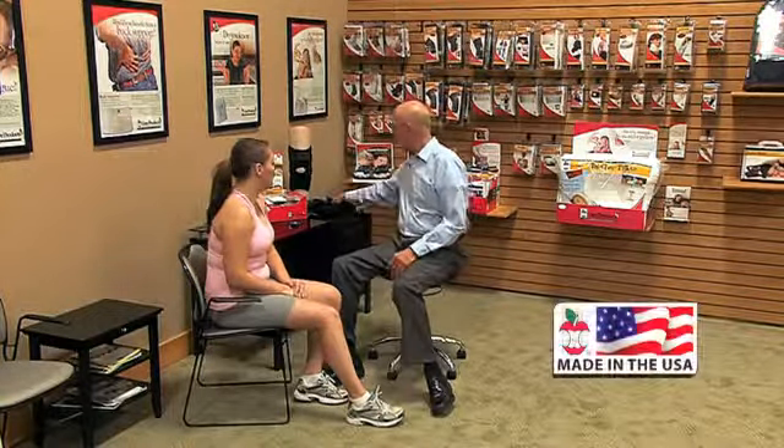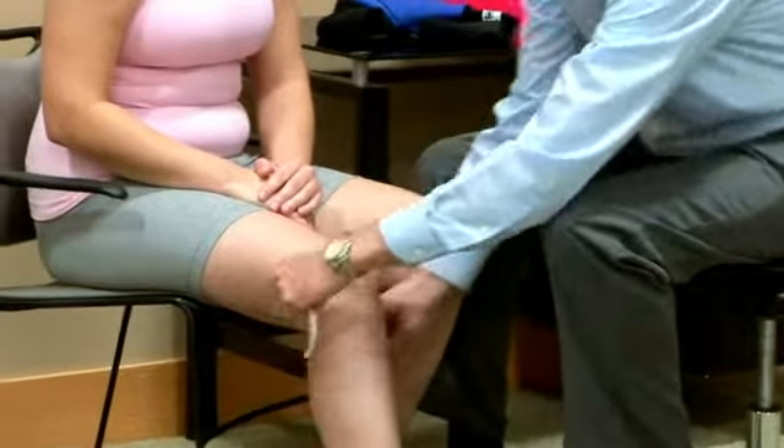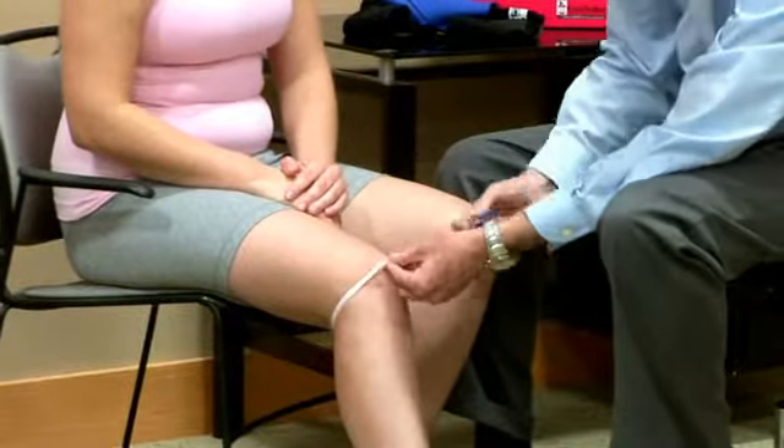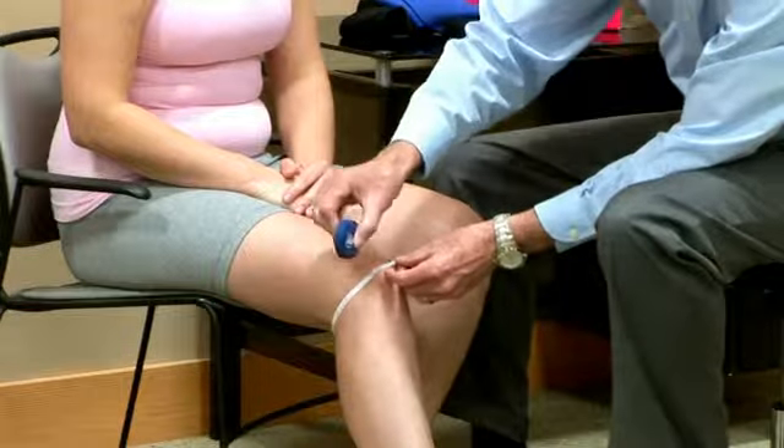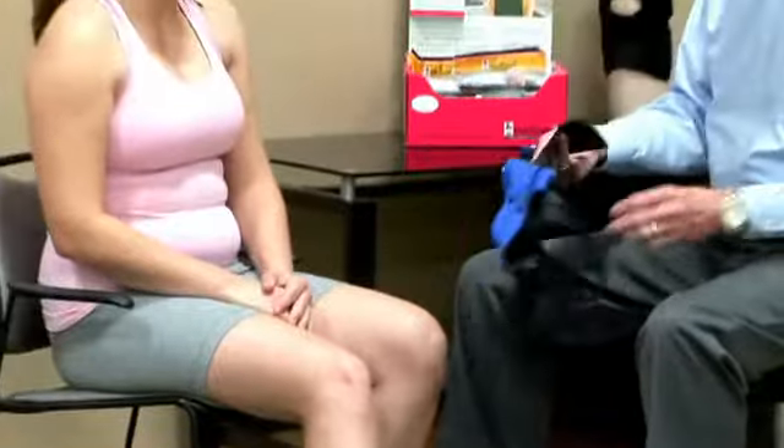So the performance wrap is this brace here. We'll start with a measurement — a knee circumference measurement with the knee flexed somewhere between 30 and 45 degrees, just a comfortably snug measurement. This is a wrap-around style brace that leaves the popliteal area open so it doesn't impinge on knee flexion at all.